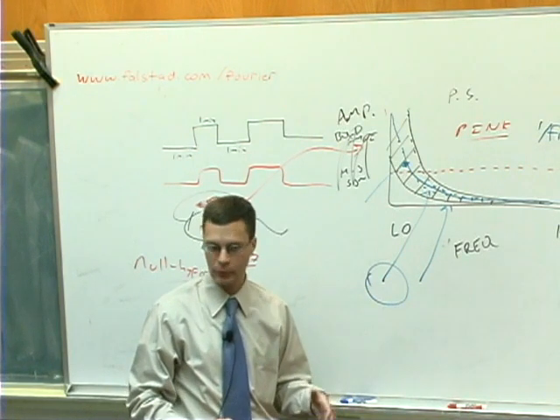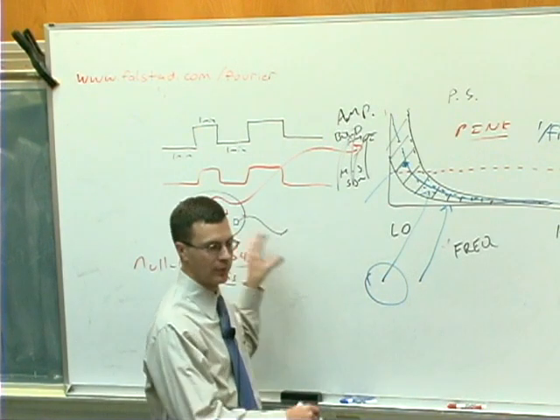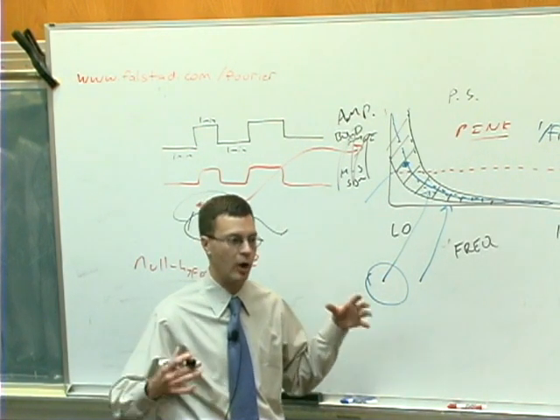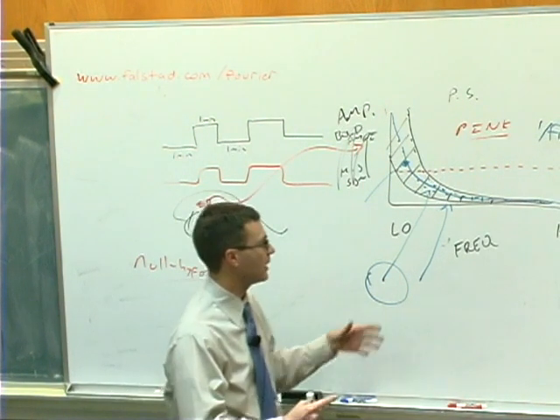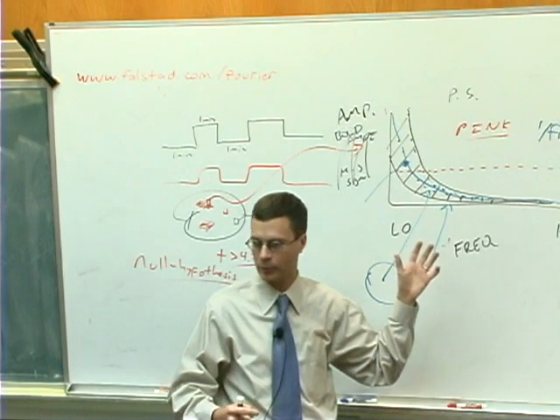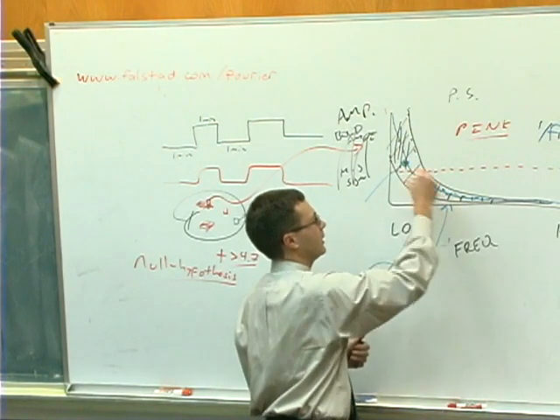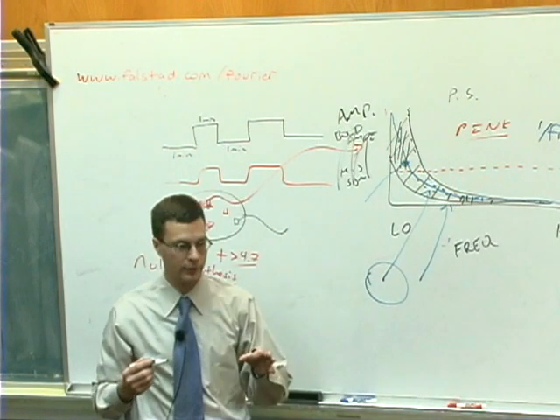Okay? So this is yet another annoying property, because it means that if we try and represent what the noise looks like across an entire brain, we're going to be systematically wrong. If we make one assumption about what the shape of the noise is like, we're going to be systematically wrong, because every voxel has a slightly different 1 over f noise property. And that assumption is worse and worse at lower frequencies as compared to higher frequencies. Okay? Yes?